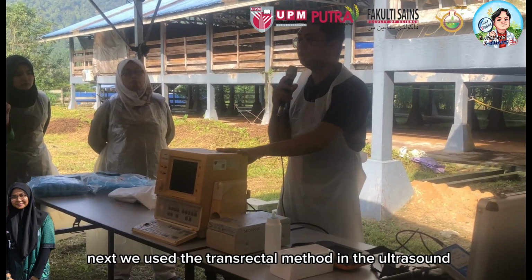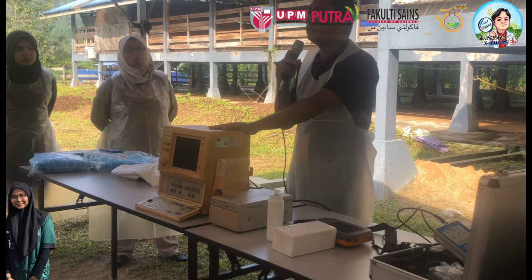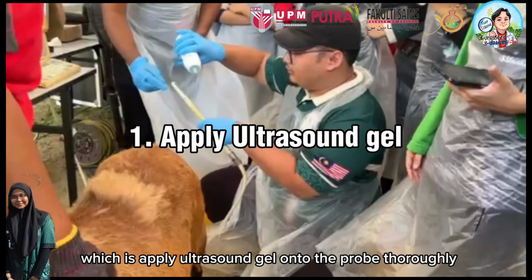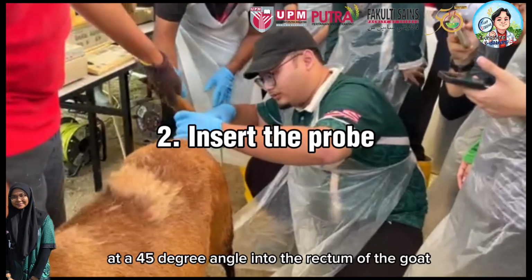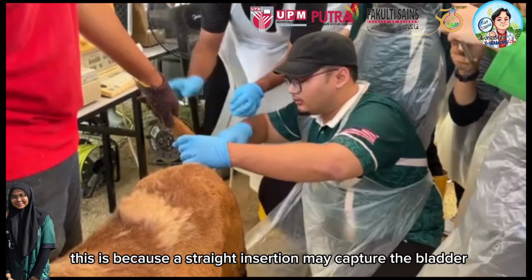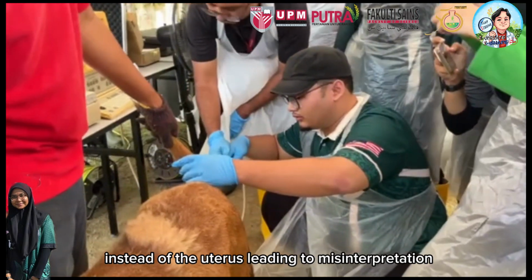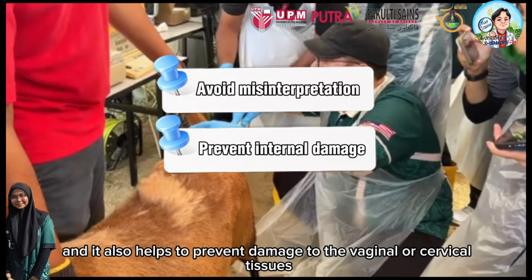Next, we use the transrectal method in the ultrasound for pregnancy diagnosis. The same step was done, which is to apply the ultrasound gel onto the probe thoroughly, and the probe is inserted at a 45-degree angle into the rectum of the goat. This is because a straight insertion may capture the bladder instead of the uterus, leading to misinterpretation, and it also helps to prevent damage to the vaginal or cervical tissues.